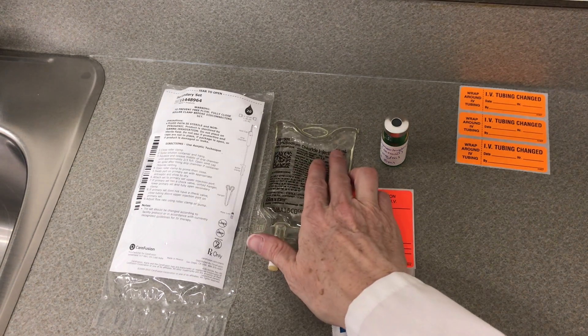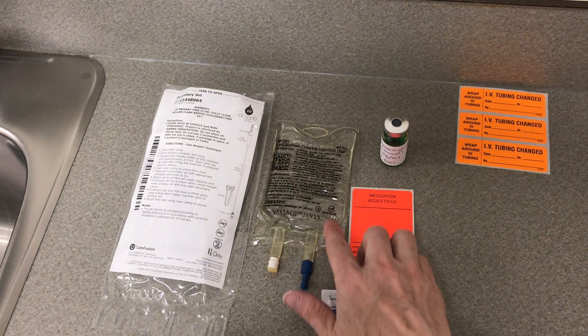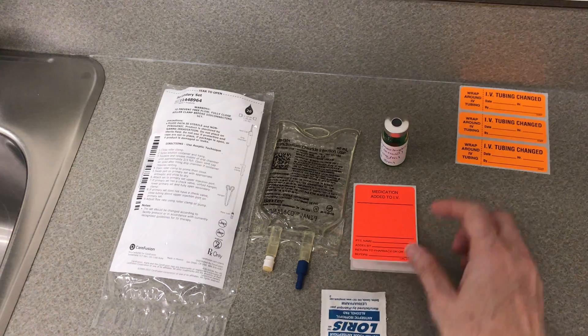Before you get started, make sure you've got the correct fluid and that it hasn't expired in order to mix up your medications.